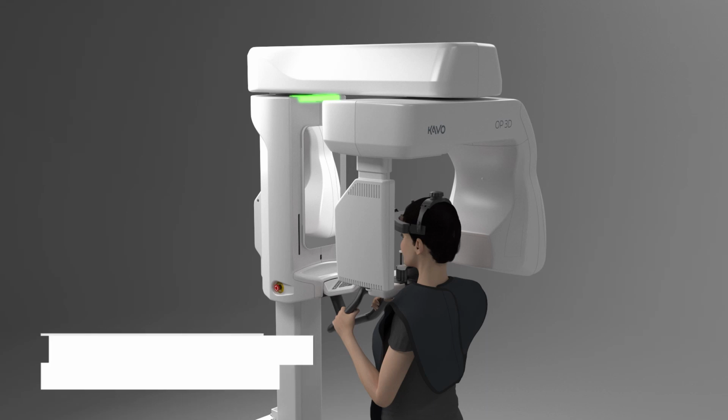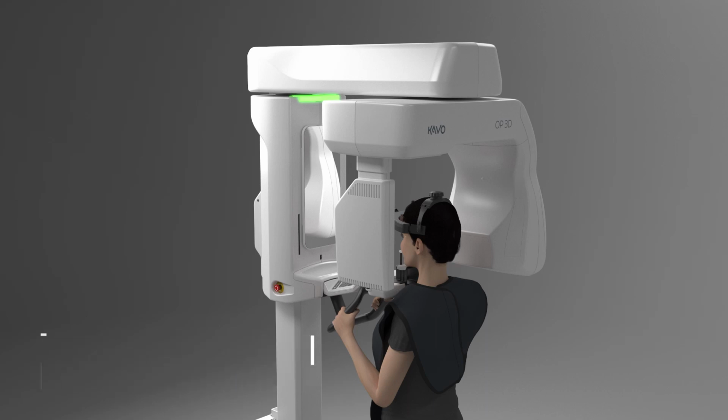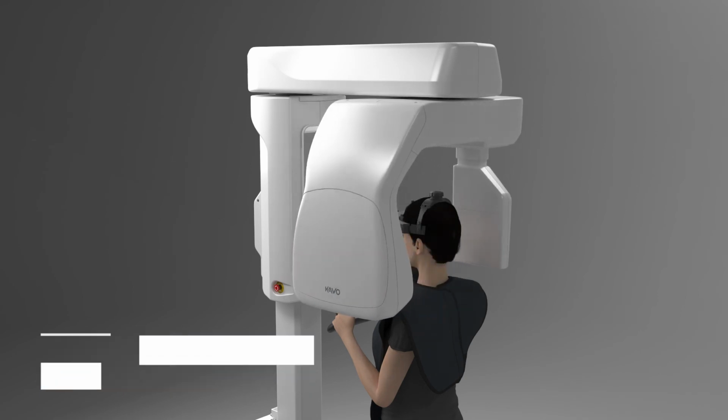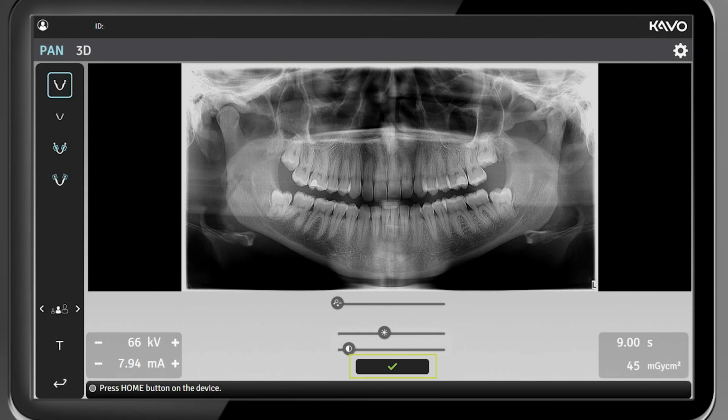Protect yourself from radiation in accordance with local safety guidelines and regulations while maintaining visual contact with the patient during exposure. Press and hold down the exposure button until the process completes. The panoramic image will appear on the acquisition workstation. Press the OK button to confirm image acquisition.